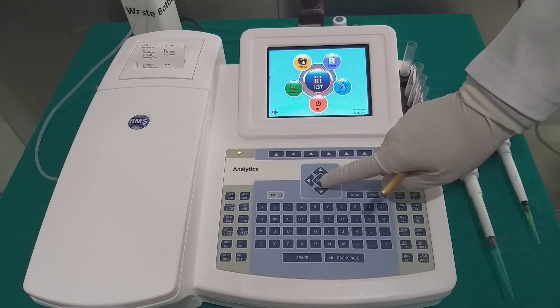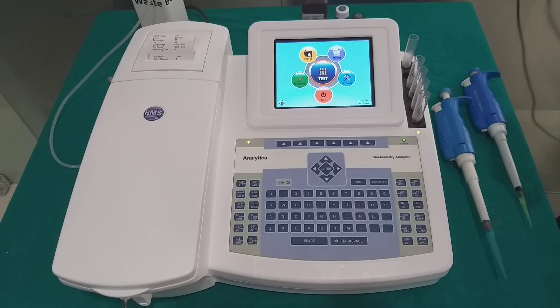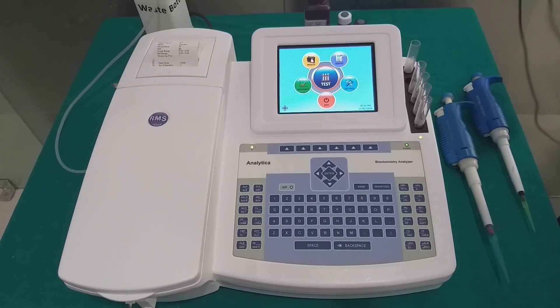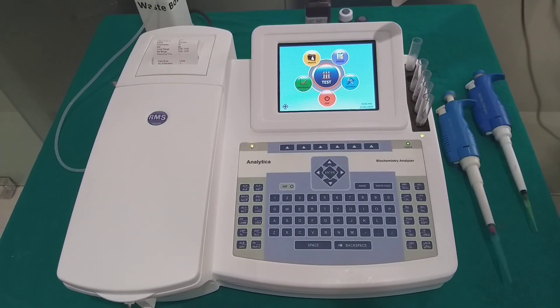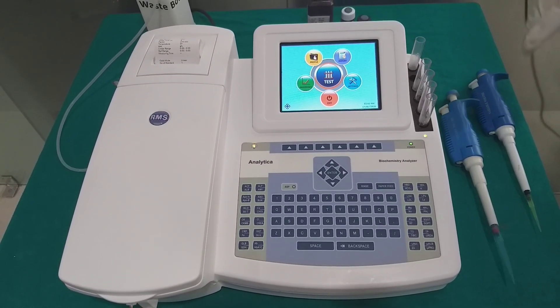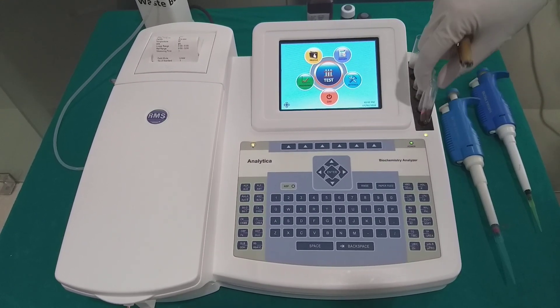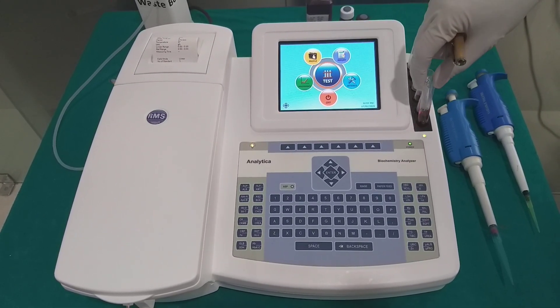We can reach these profiles by using this menu and selecting that option. Analytica has an embedded system with a 5.6-inch screen with color TFT display. This analyzer has a six-position dry bath incubator for the facility of incubation of the reagents.